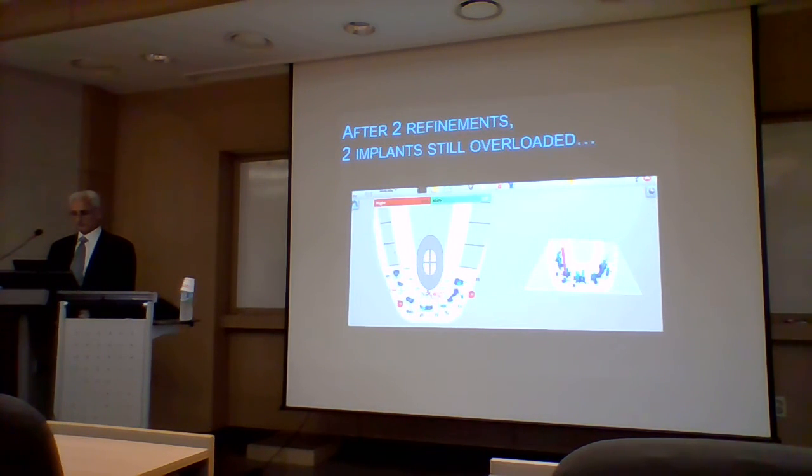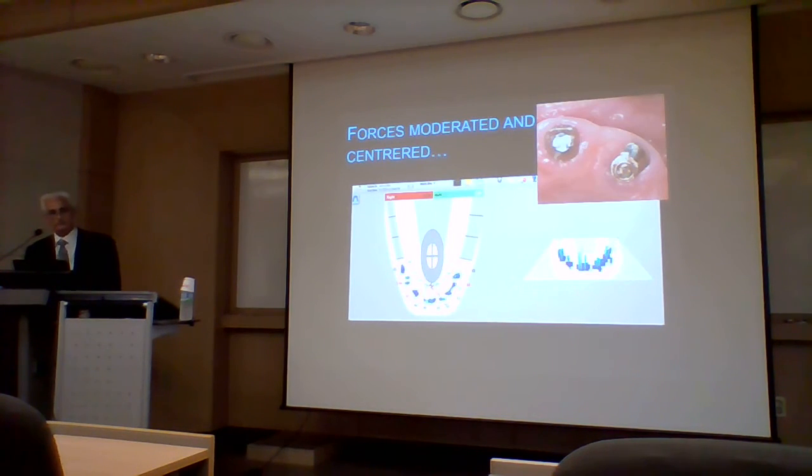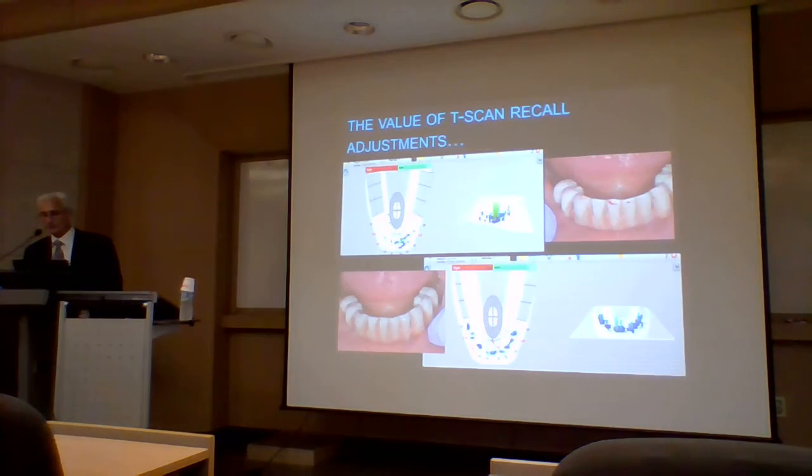And then after another correction, we have it very similar to how it was at delivery, with slight force increase where the rigid elements are. And the importance of the recall adjustment is that you can manage these force problems across time and preserve the prosthesis.